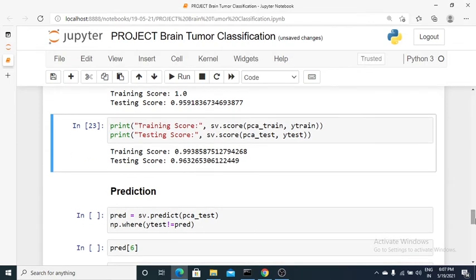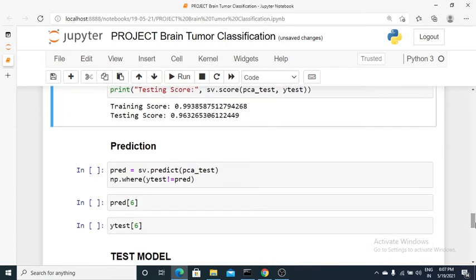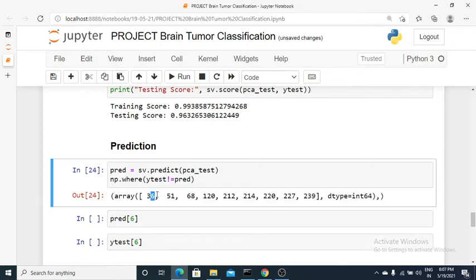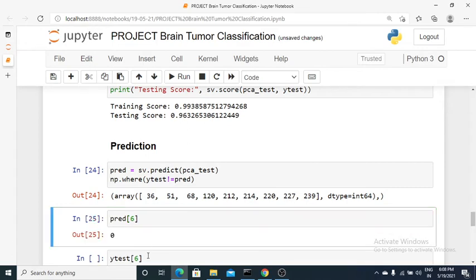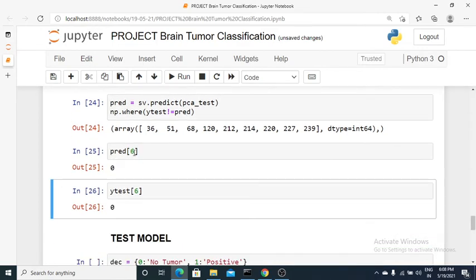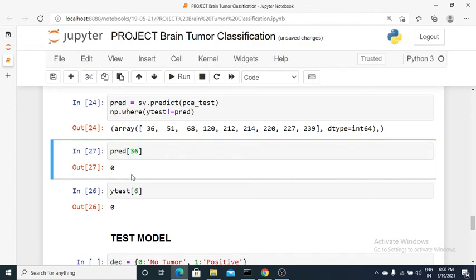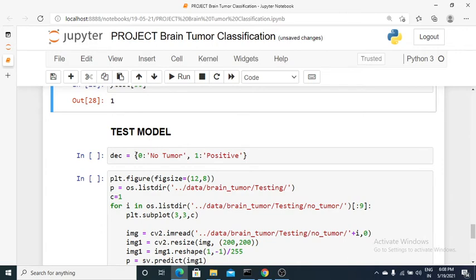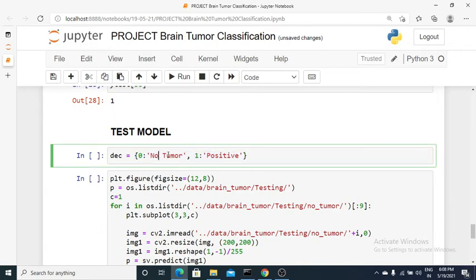I'll proceed with the SVM model. To check where predictions don't match the actual labels, I'll use np.where. Those indices indicate where the model has misclassified samples. For example, at index 36 the model predicted 0 (no tumor) but the actual label is 1 (tumor). You can visualize these misclassified samples to inspect them.